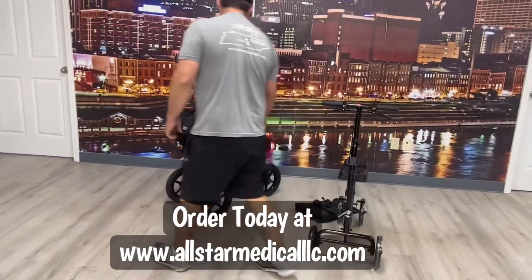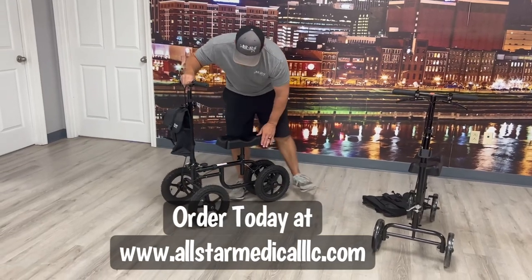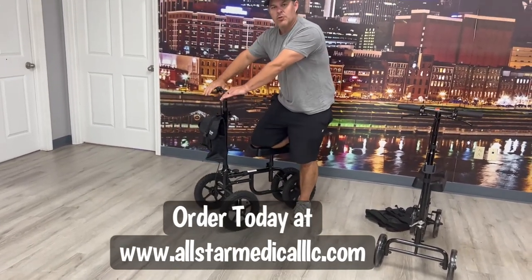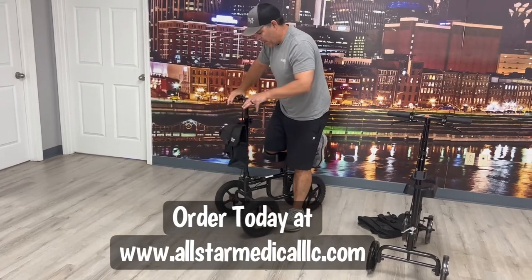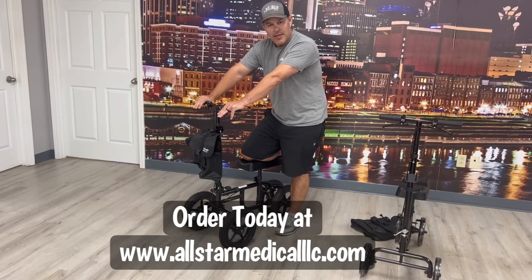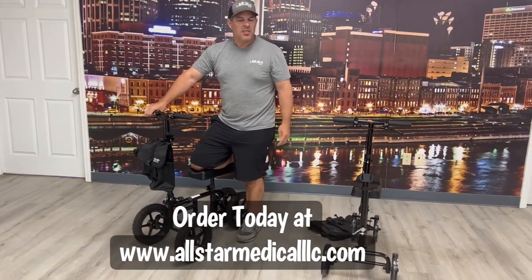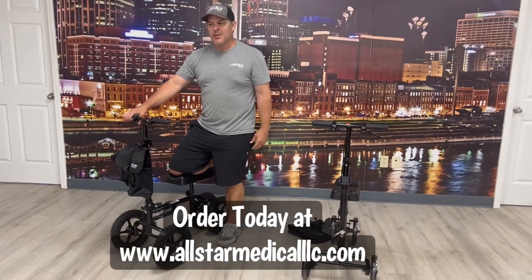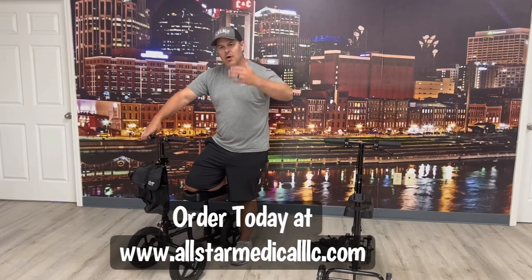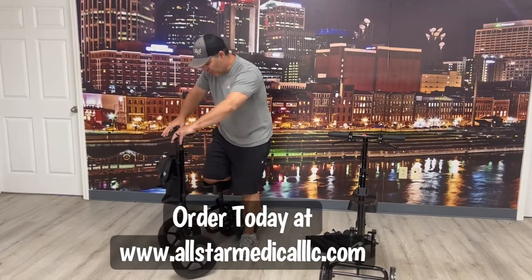Everything is the exact same on both models — there's nothing different other than the wheels. You'll notice how much bigger the all-terrain wheels are; they go over terrain a lot better. If you're outdoors a lot, the all-terrain may be the way to go. If you're using it inside, stick with the standard one. Nine out of ten we sell are the standard, so unless you're a really tall individual or outdoors all the time, there's no need for the all-terrain.